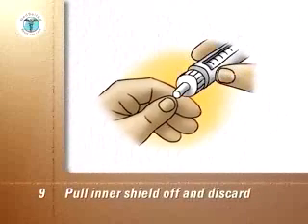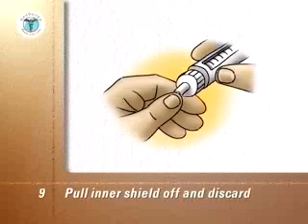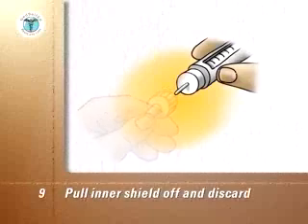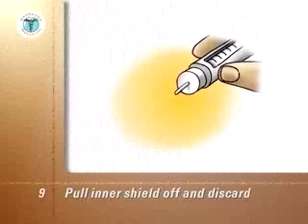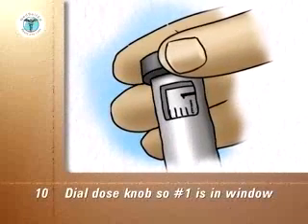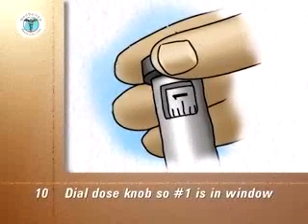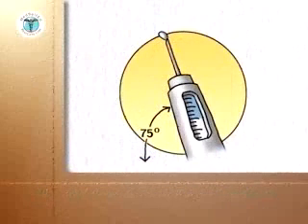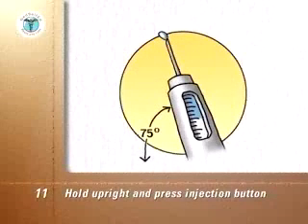Pull the inner shield off the needle and discard it. Hold the pen upright and tap the cartridge holder to enable air bubbles to escape through the needle. Dial the dose knob so that number one is in the dose scale window and prime the pen according to the manufacturer's instructions. Hold the needle upright, press in the injection button at the end of the unit, and check that insulin comes out of the tip of the needle.